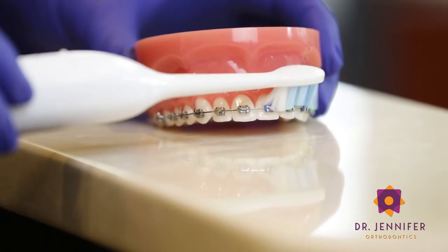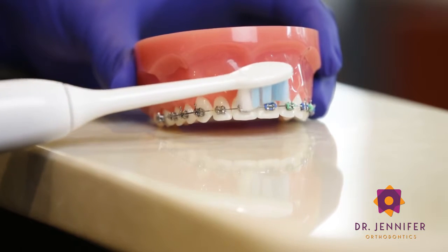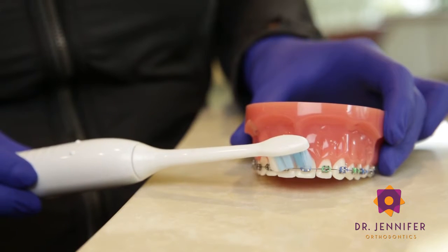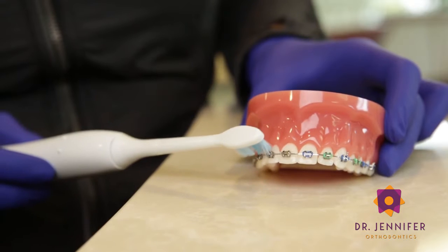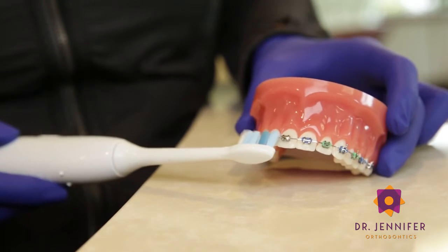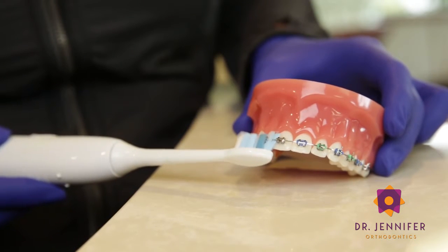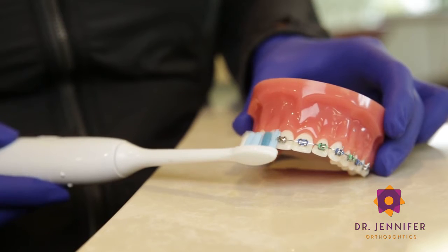The nice thing about the Sonicare is you don't have to brush the teeth — you allow the toothbrush to do all of the work. Still, brush the front of the brackets, and then you'll also want to get underneath the wire. Angle your toothbrush so that the bristles can get in and underneath and in between the wire and the brackets.